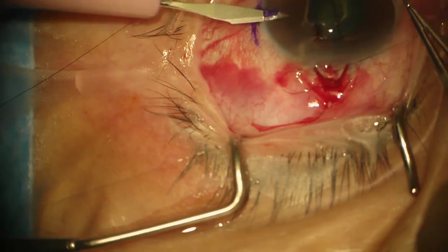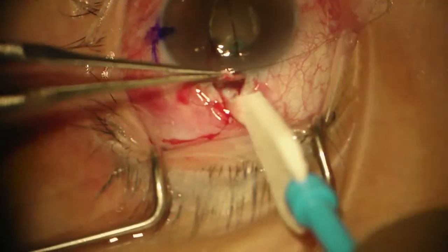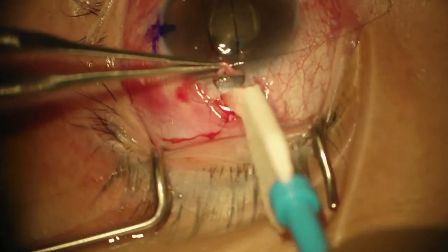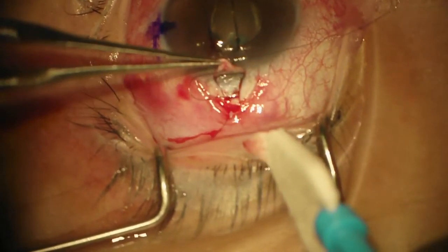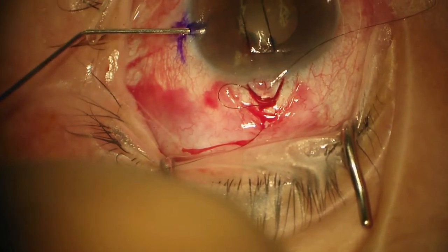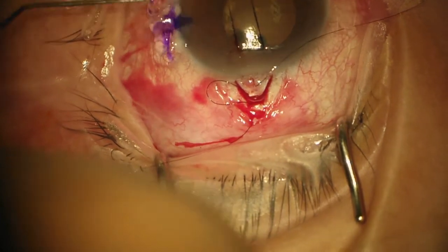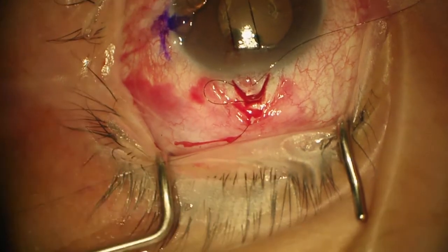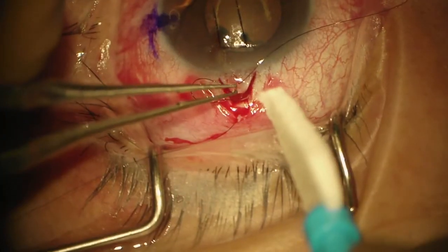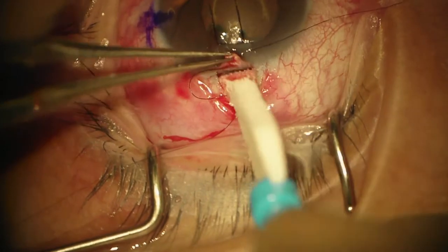We'll make a paracentesis. I'm going to keep that flap centered right now. You do not have to use Healon during trabeculectomy — you can try to either use an anterior chamber maintainer or replace your stitch and be sure that you can close the eye very quickly.